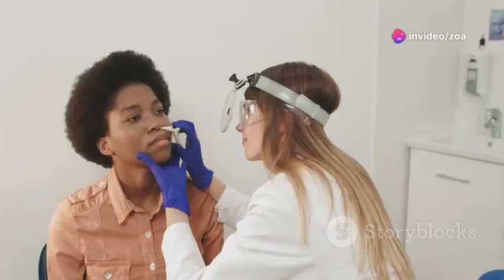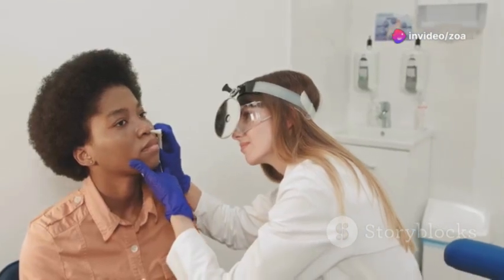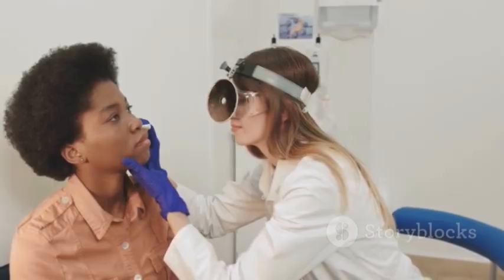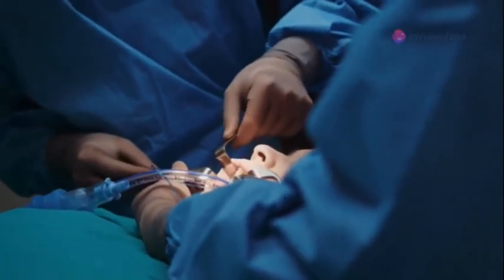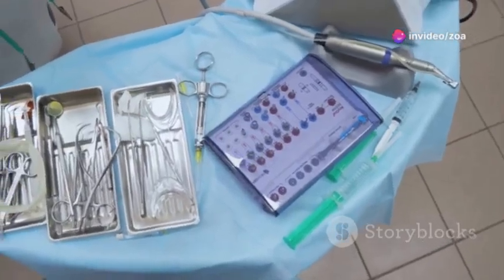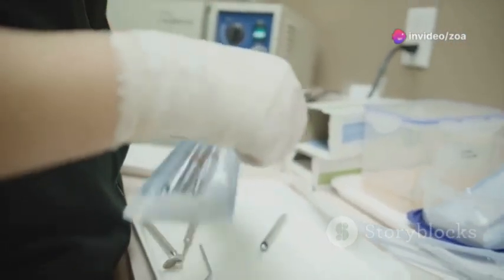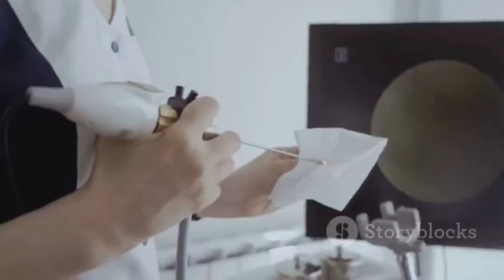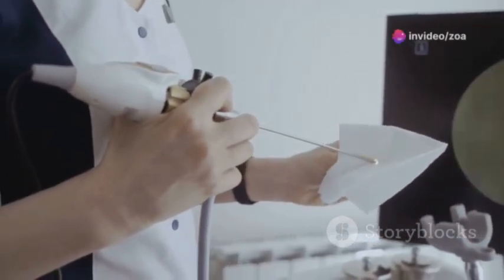Blind nasal intubation is a technique for placing an endotracheal tube through the nose and into the trachea without direct visualization of the larynx. It relies on tactile and auditory cues to guide tube placement. Gather necessary equipment: endotracheal tube or ETT, stylet, lubricant, syringe, suction, oxygen source, and airway adjuncts. Choose an ETT size smaller than what would be used for oral intubation.